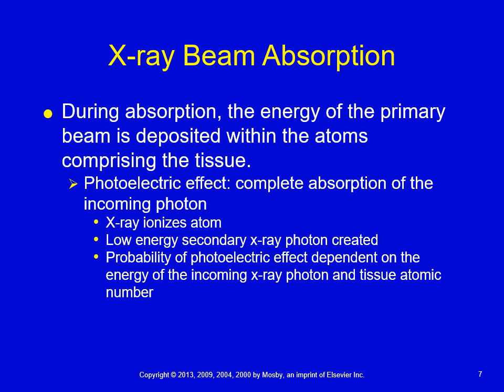They are hitting tissue atoms and interacting with inner shell electrons of those tissue atoms. So if we drew out an atom where the innermost shell is the K shell, the X-ray photons have enough energy to knock that K shell electron out, and as a result, it gives up all of its energy doing that. So it's going to be completely absorbed.